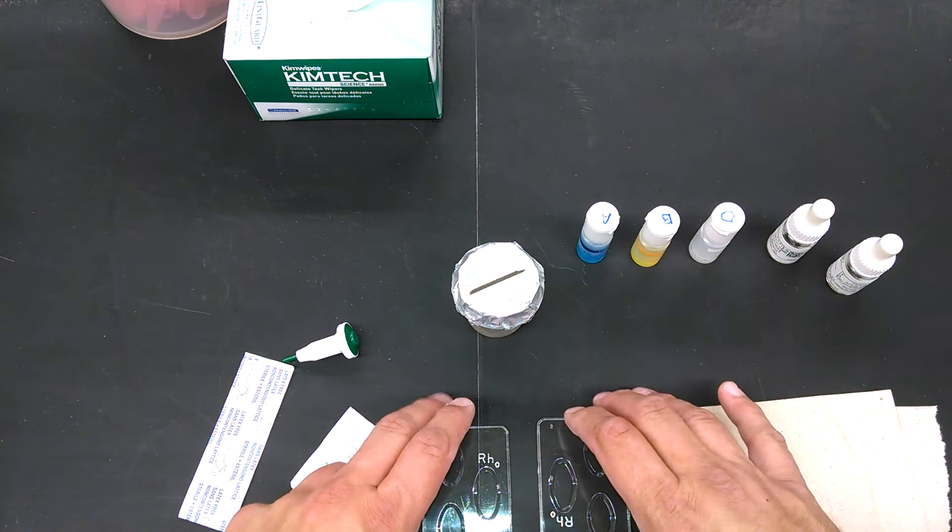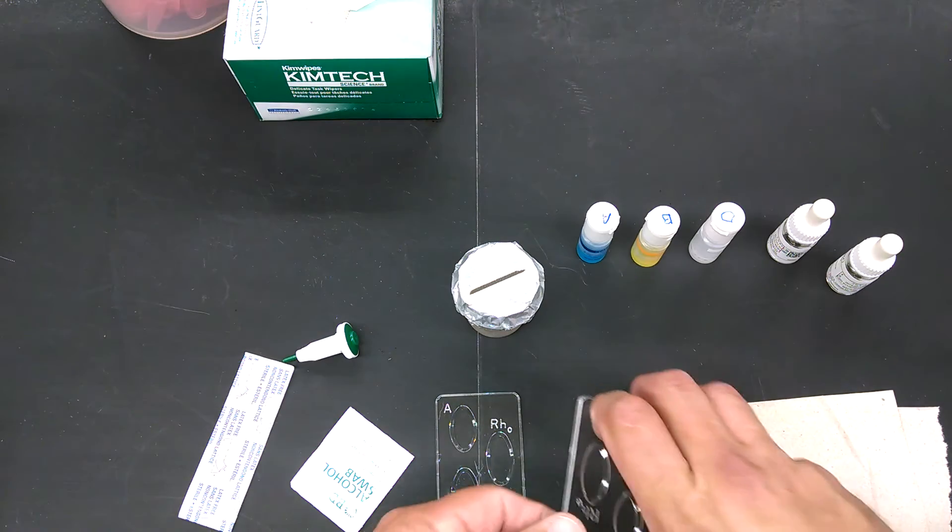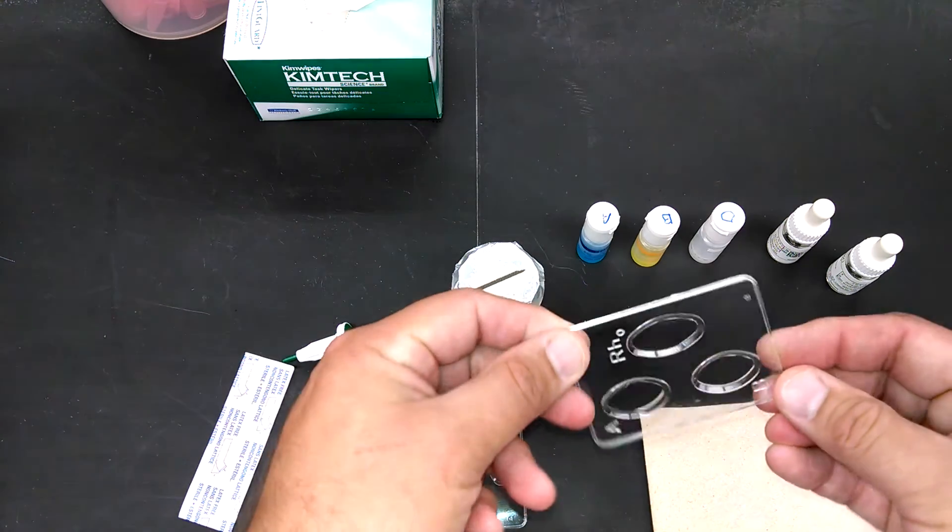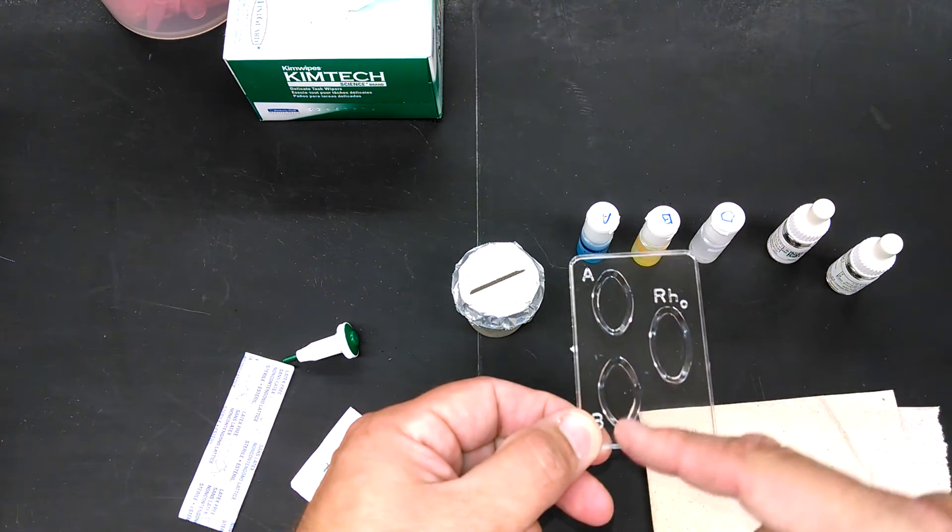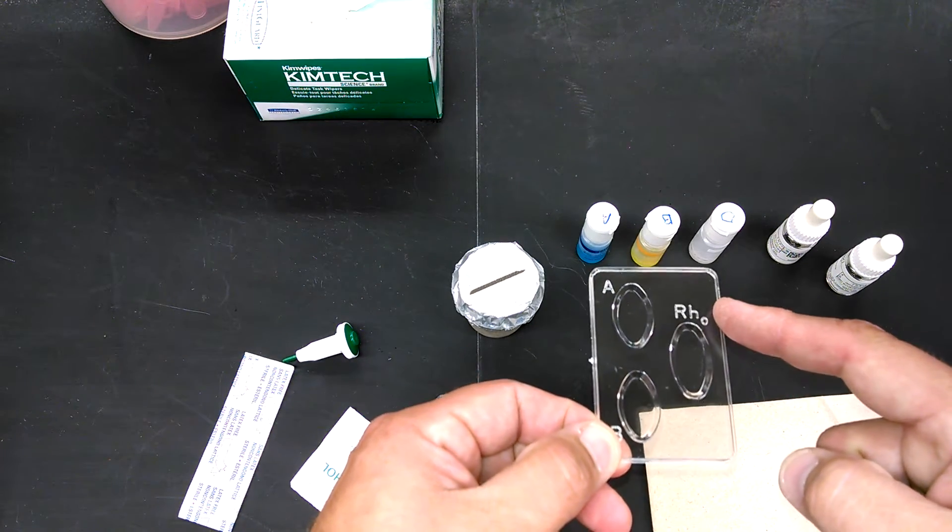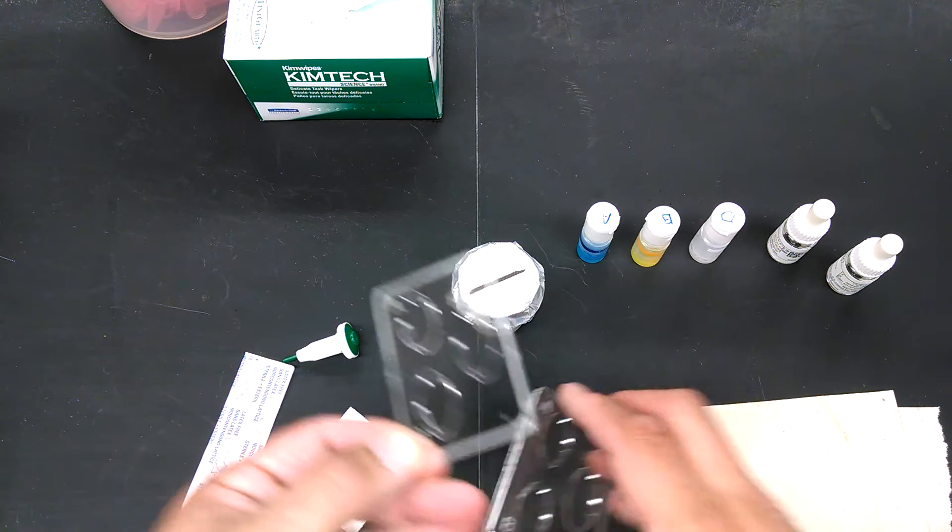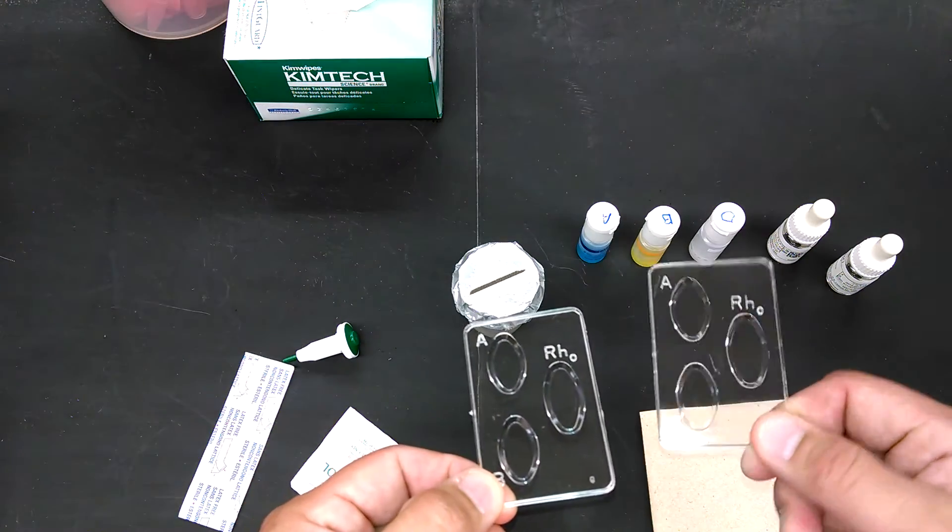We have some fancy kind of well trays, and they're already labeled A, B, and RH. So that's D. But there aren't any that exist that are already labeled M and N.